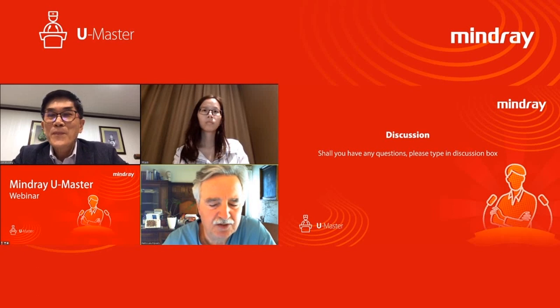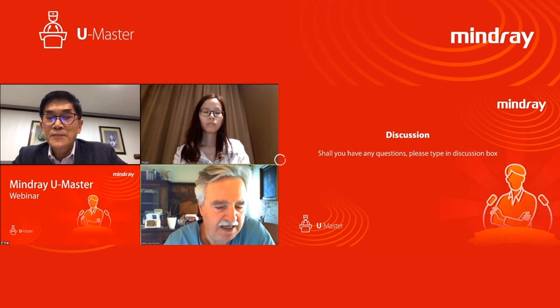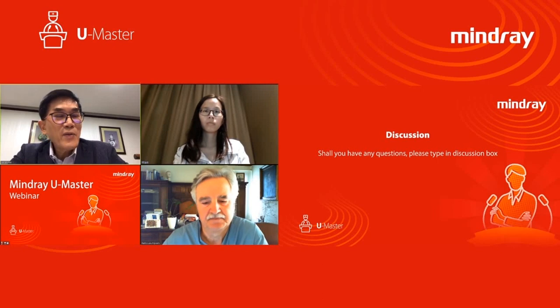I can speak mostly about imaging data: ultrasound and elastography have the advantage over other imaging modalities in order to classify liver fibrosis, liver steatosis, and portal hypertension, giving, let's say, a holistic view about what is happening in the liver and the portal system. Thank you very much.